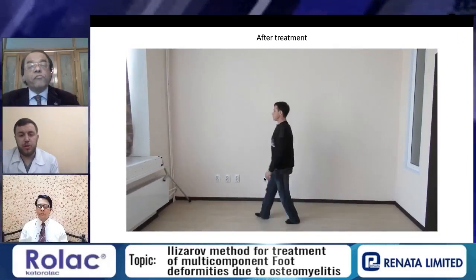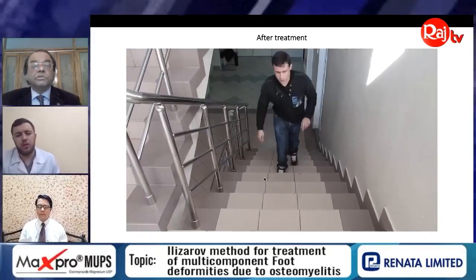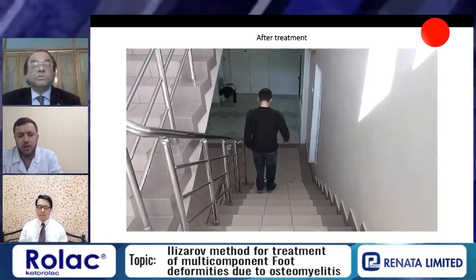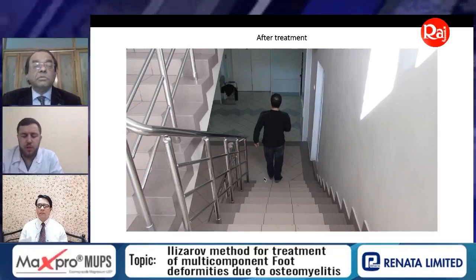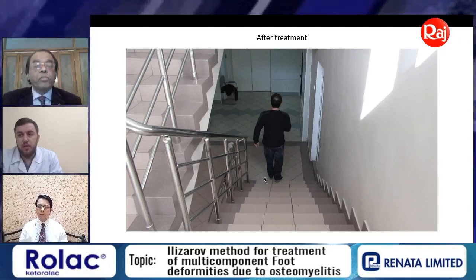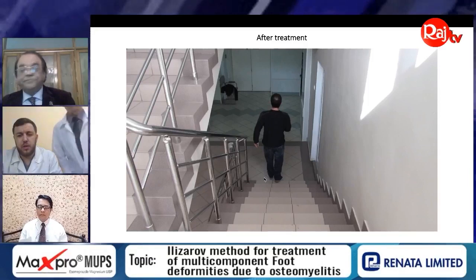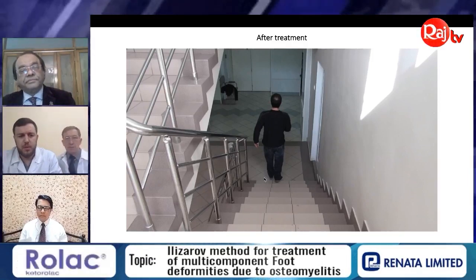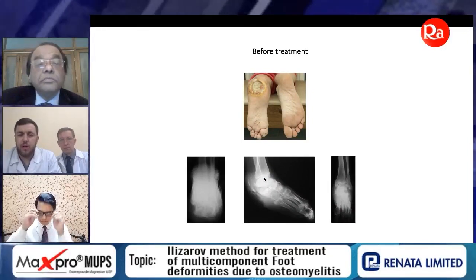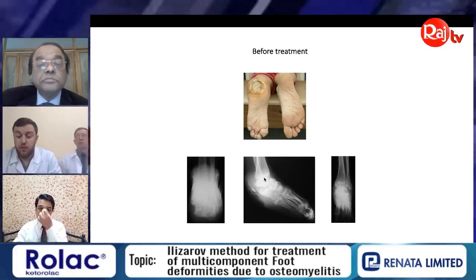I repeat, the patient had problems with the right foot, and now we can see how the patient can use his foot in walking, and importantly, here using simple shoes, without crutches or sticks. So, and in that case, we come back to a case with ulceration on the hindfoot.